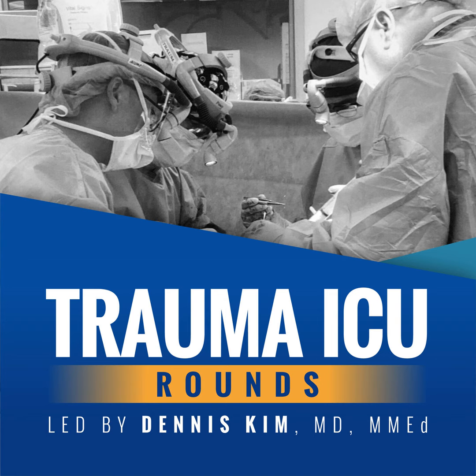In terms of the overall goals and objectives, I think you really want to think about these in terms of the indications for intubating and ventilating a patient. First and foremost, we want to support or manipulate pulmonary gas exchange, both in the sense of improving patients' alveolar ventilation and arterial oxygenation. Again, when it comes to augmenting a patient's overall ventilation, we do want to bear in mind that in certain circumstances, for example patients with ARDS, we don't want to go too crazy in terms of lung volumes, as this may ultimately result in what's known as VILI, or ventilator-induced lung injury.